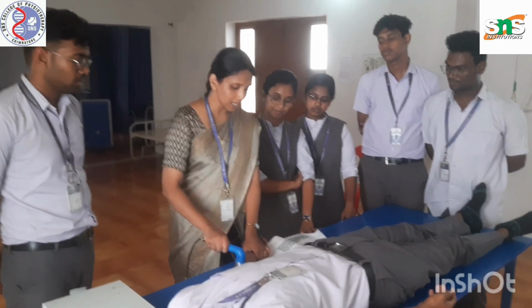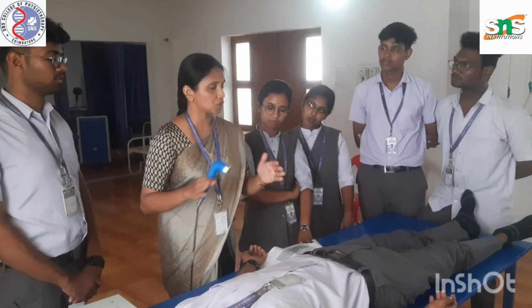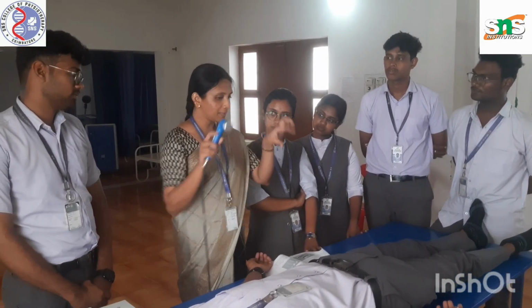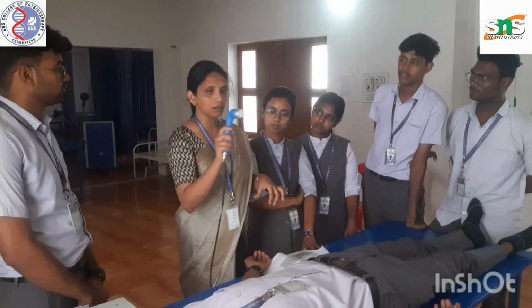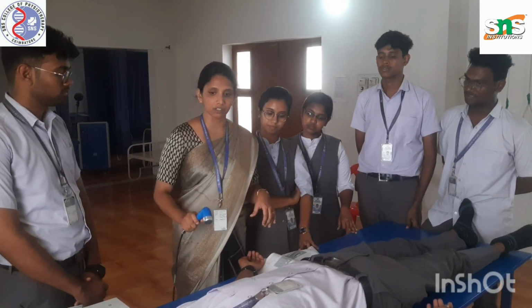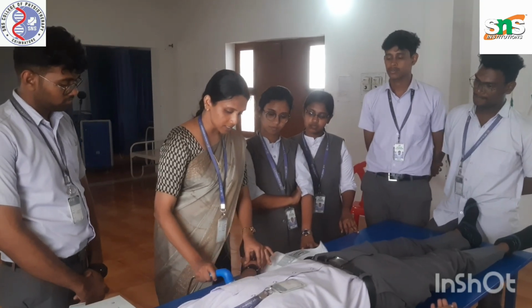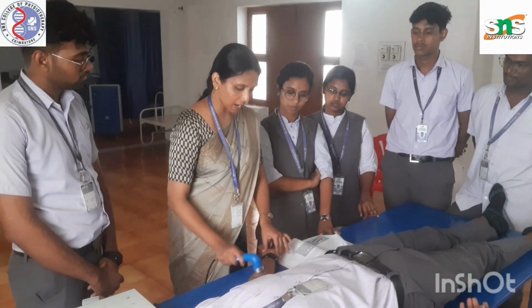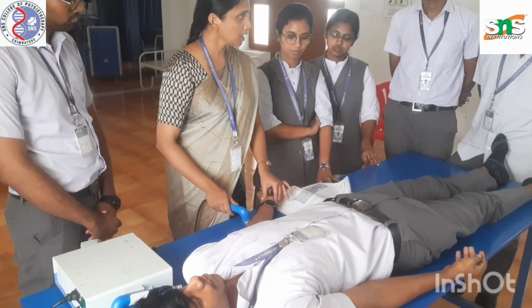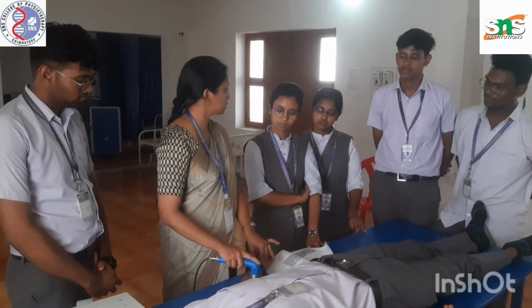The next one is the transverse strokes. The transverse strokes can be applied in the back region, which is the biggest region, so that you cannot complete the treatment with single circles. So we can apply in transverse directions. Then the next one is the longitudinal. This kind of strokes, parallel strokes, longitudinal strokes can be applied. The transducer head has to be in contact during the session.